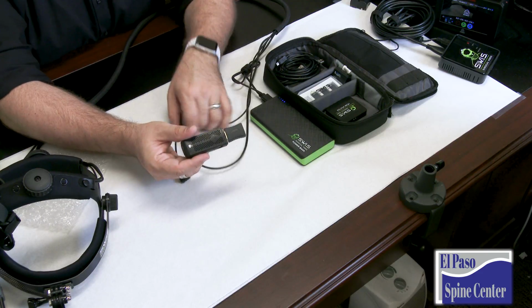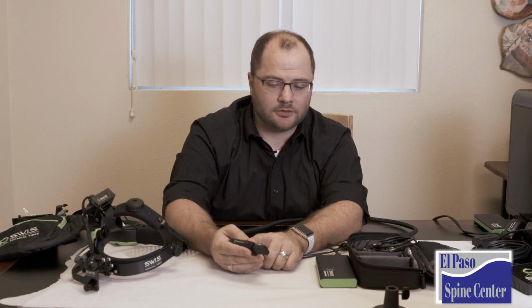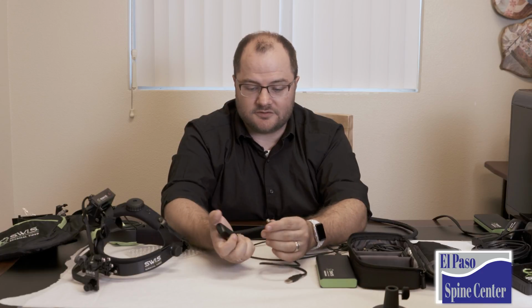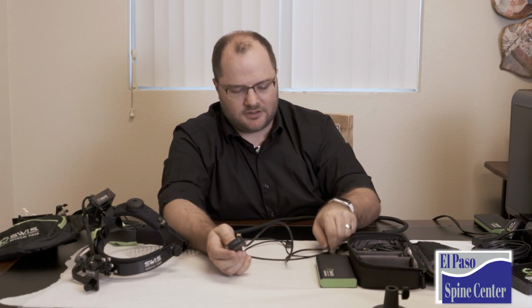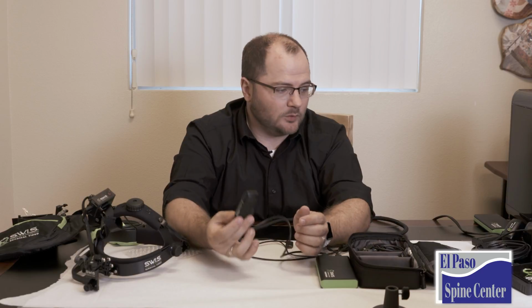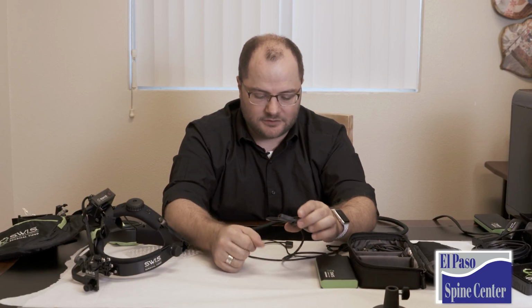I'm going to pull out my wireless transmitter. The wireless transmitter has a mini USB power input because it needs power to actually transmit. So I'm going to grab this small full-size USB to mini USB. It's not micro, it's a mini USB. I'm going to plug this in, plug that into my power supply, and I get a blue light telling me that I'm now wirelessly transmitting. Still don't have anything to transmit because I don't have any input here.